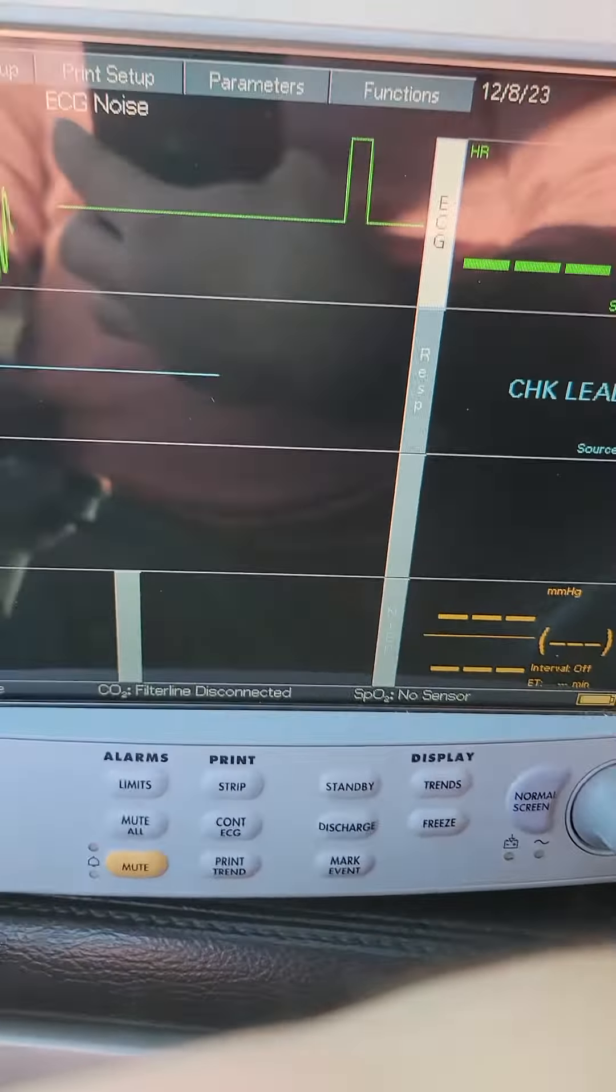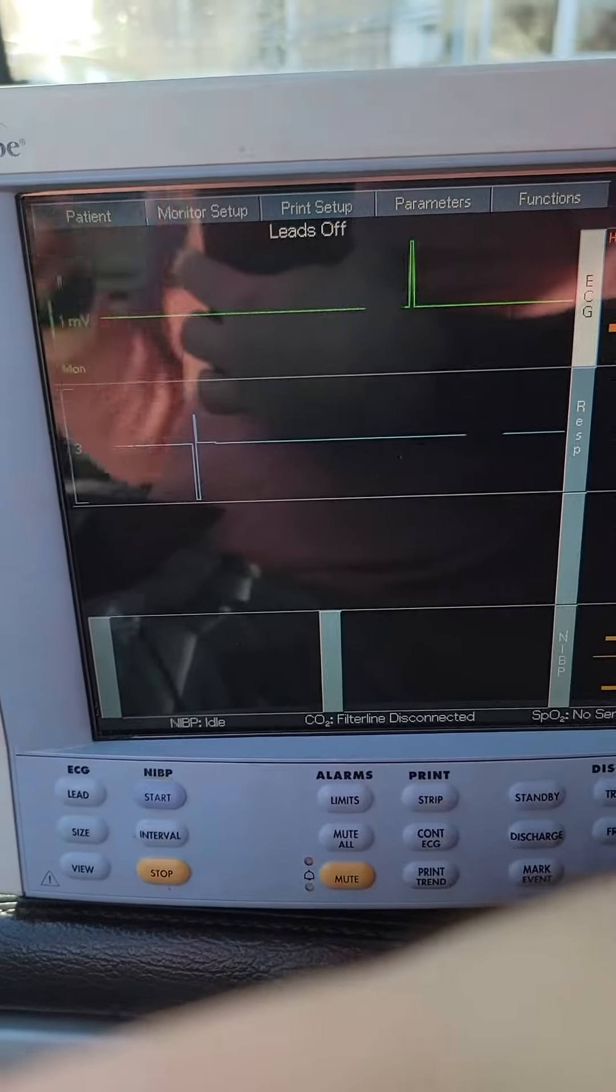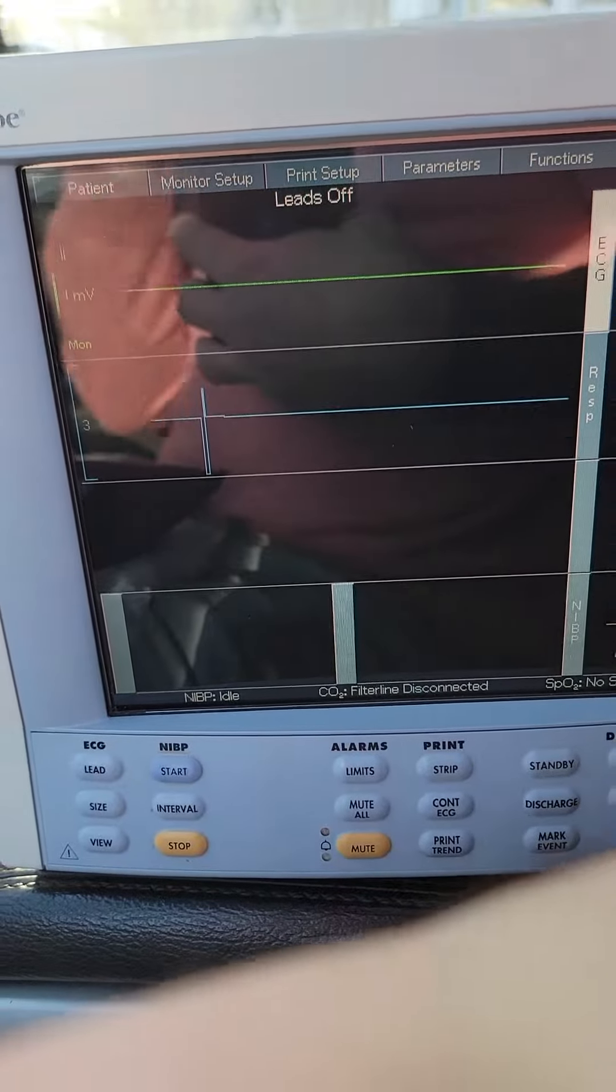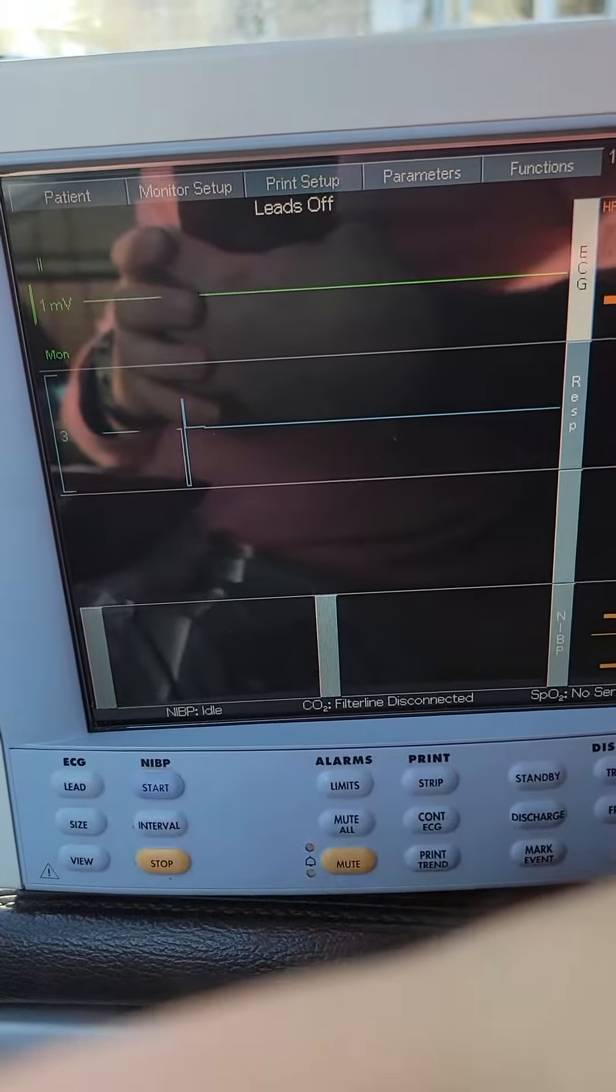So everybody check that out before you send it to a depot or before you say it's not working. Check to make sure your ECG lead set is set to what you have and not auto. All right, thanks.